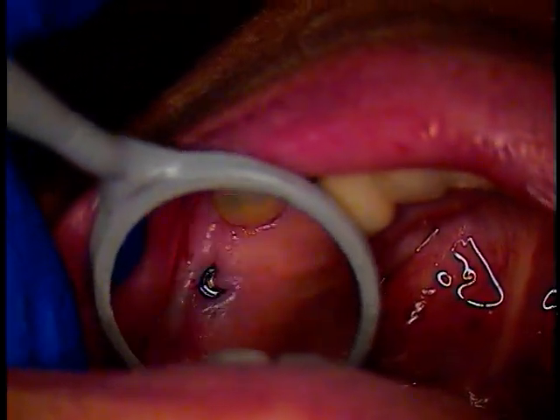Right now what we're looking at is the opening of the screw itself, the top of the screw. You can see it's color-coded blue. Blue indicates the certain diameter of this implant — I believe it's a regular neck or a wide neck. The object is in the middle.